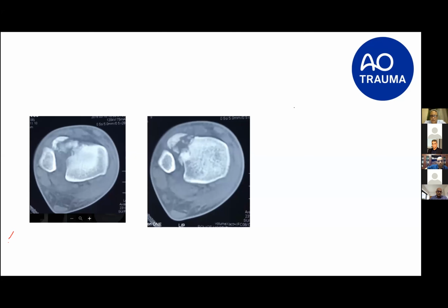But if we have the loose body in the syndesmosis and we do not restore the tension of the AITFL, this part would still remain abutted anteriorly and we would have lost a part of the syndesmosis. I don't know, this is just my opinion about this.